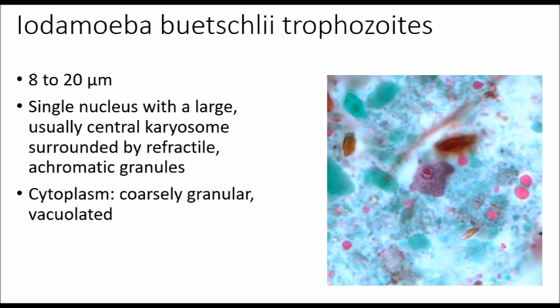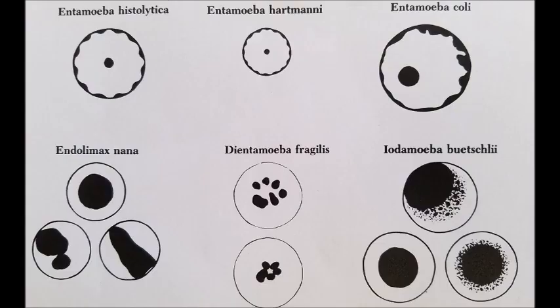This last slide gives more detail on distinguishing species based on the nucleus. Entamoeba histolytica in the upper left has a central karyosome with even peripheral chromatin. Next to it, Entamoeba hartmani looks the same but is smaller. Entamoeba coli has an eccentric karyosome and irregular peripheral chromatin. In the bottom left, Endolimax nana has a large, blot-like karyosome lacking any peripheral chromatin. And on the bottom right, Iotamoeba bushleyi also has a large karyosome.